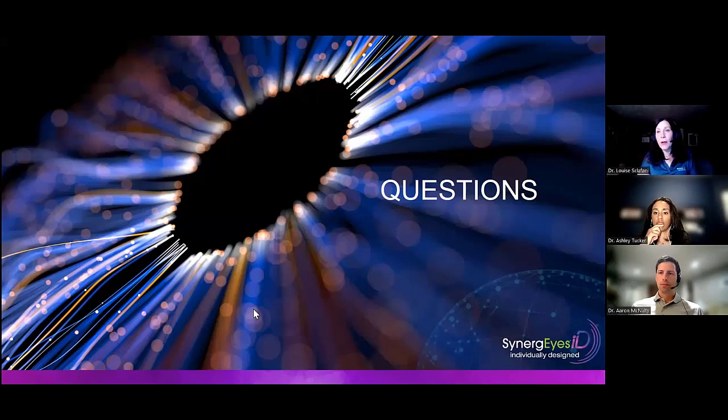We have a question about patients who have higher order aberrations because of RK. First of all, I would recommend that this lens not be used on irregular corneas at all. This lens is designed for the regular cornea. If you have an irregular cornea, post-surgical or disease-induced, use either the Ultra Health lens. We do have some doctors who use Duet off-label with great success, but I would recommend the Ultra Health or switching over to the SynergEyes VS if that's the situation.